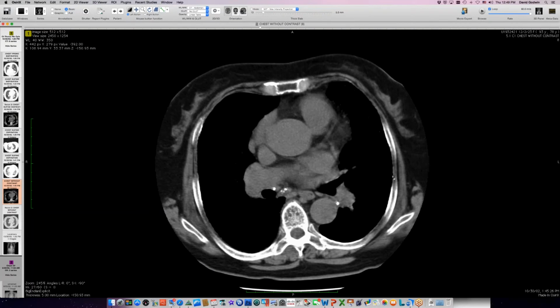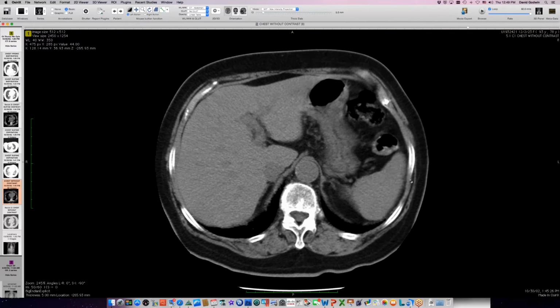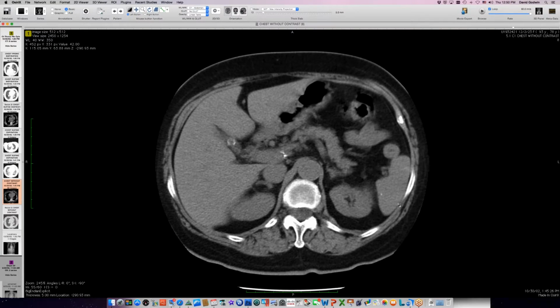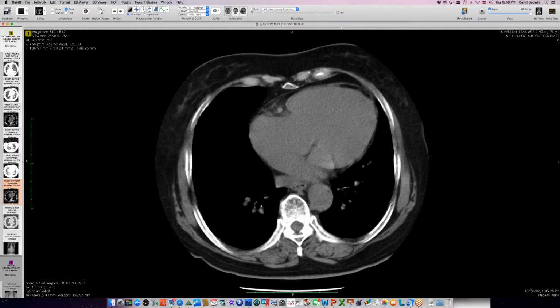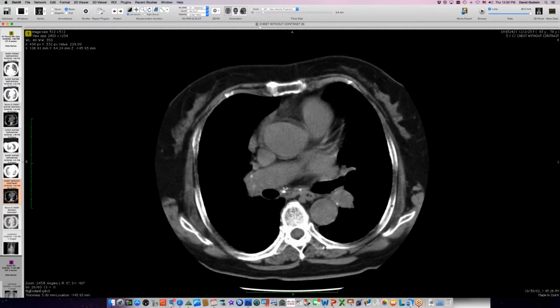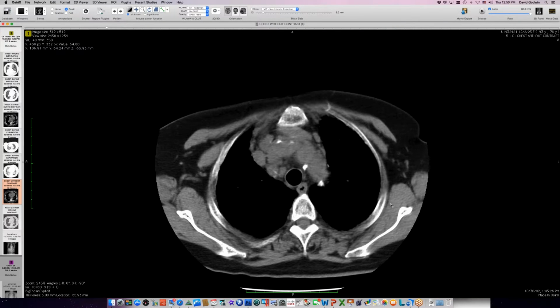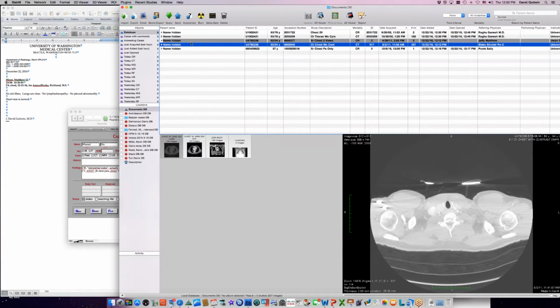So Sadaka or Pipavat says that in India, the most common cause of splenic calcification is TB. In this country, it's histo, and we often use that as a distinguishing feature to say it's likely histo. There's one little calcification, and not TB, but this shows you that you can get calcifications in the spleen from TB. But David, have you ever seen? I've never seen. It makes sense because it's the same drainage of the pathophysiology. But with the histo, the case I showed earlier today had tons of calcifications, and I've never ever seen that with TB. I've seen a couple. Chris was saying fewer than 5, which kind of makes sense, and that's what they did in Cincinnati, where they had even more histo than we have here. I think that's a pretty good rule of thumb. If you got what I call the speckled spleen, you can chalk it up to histo.